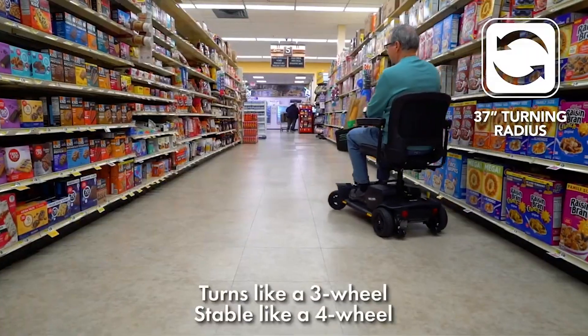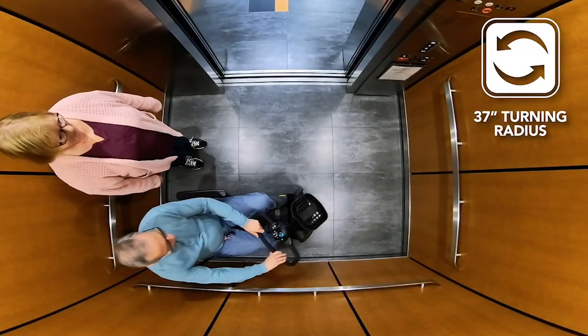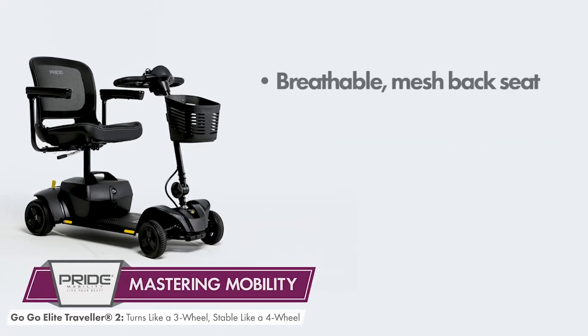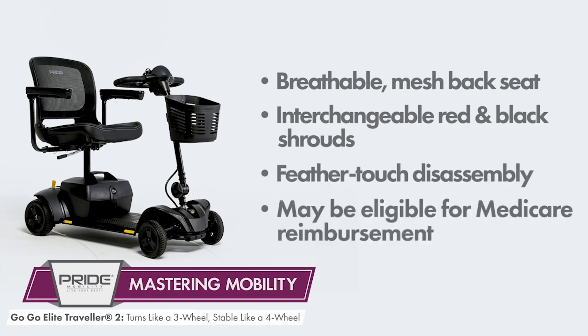Introducing the GoGo Elite Traveler 2 4-Wheel Scooter from Pride Mobility Products, featuring 4-wheel stability and 3-wheel turning ability. The GoGo Elite Traveler 2 has a breathable mesh-back seat, comes standard with interchangeable red and black shrouds, offers feather-touch disassembly for convenient portability, and may be eligible for Medicare reimbursement should you qualify.